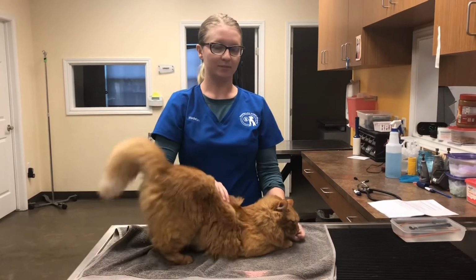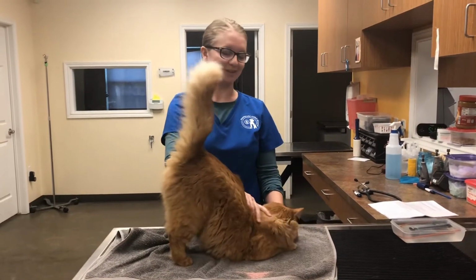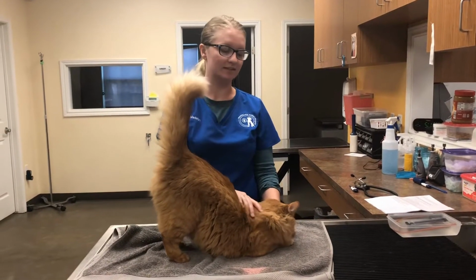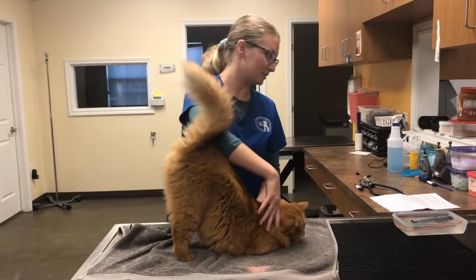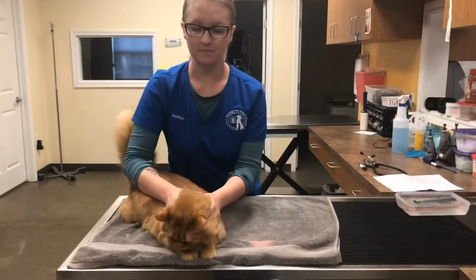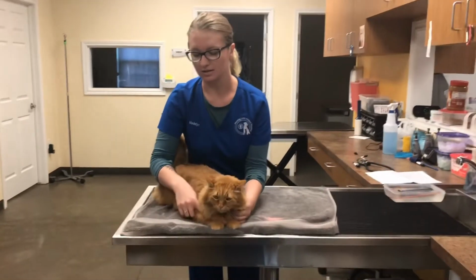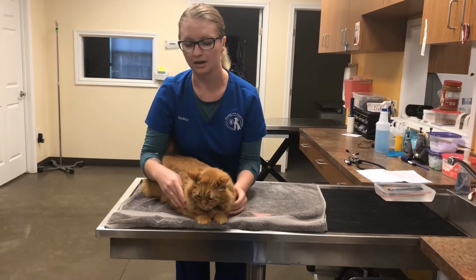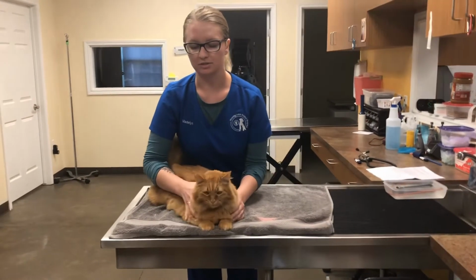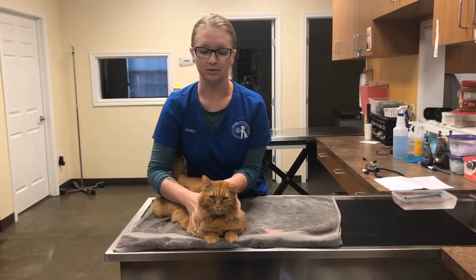Okay, now we will be demonstrating restraint for blood draws on a cat for the cephalic, jugular, and saphenous veins. The first one that I'm going to demonstrate is the cephalic. So we'll have our patient sternal, and the cephalic vein runs along each front forelimb here on the dorsal aspect of the limb. So what I'm going to do is keep my patient sternal, restrain him with one hand, so I'll do a light scruff.